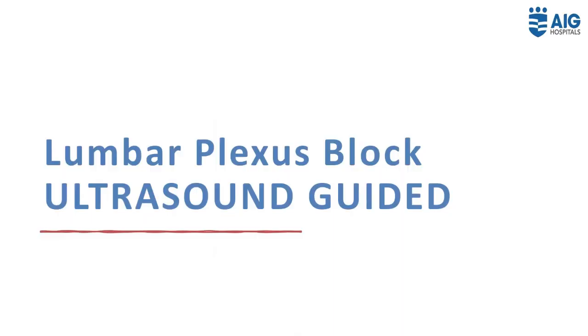Let's now discuss USG guided lumbar plexus block. Depth of the lumbar plexus necessitates the use of low frequency and curved array transducers to image anatomy. Low frequency ultrasonography provides good penetration, but it lacks spatial resolution. Hence, it is prudent to use PNS in conjunction with USG for nerve localization during USG guided lumbar plexus block.